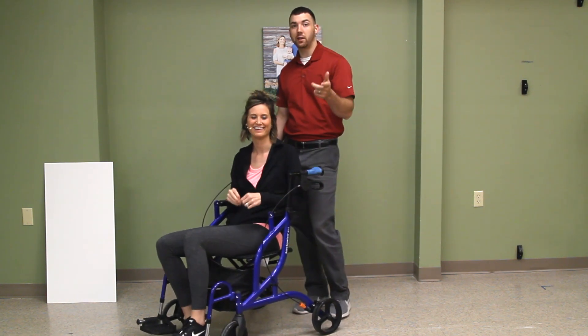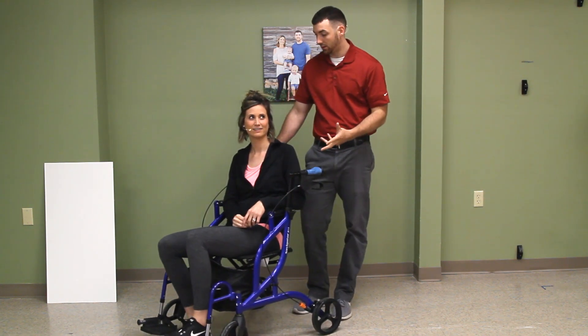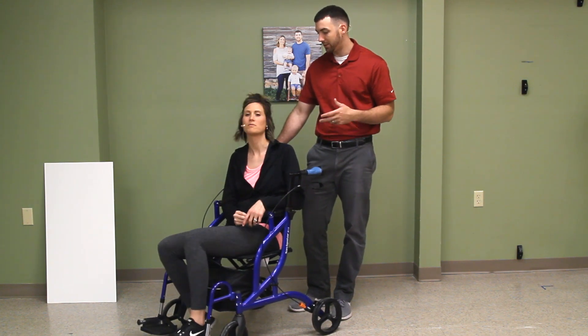We hope to make your family life easier as life gets less mobile — immobile. I was going to say debilitating. Yeah, it's debilitating.